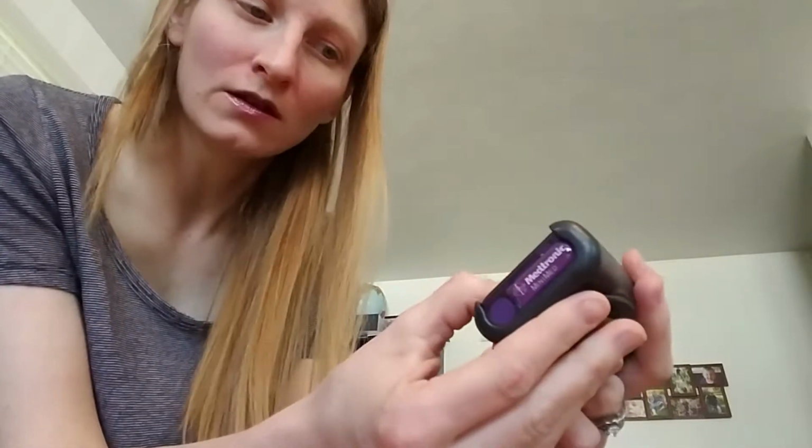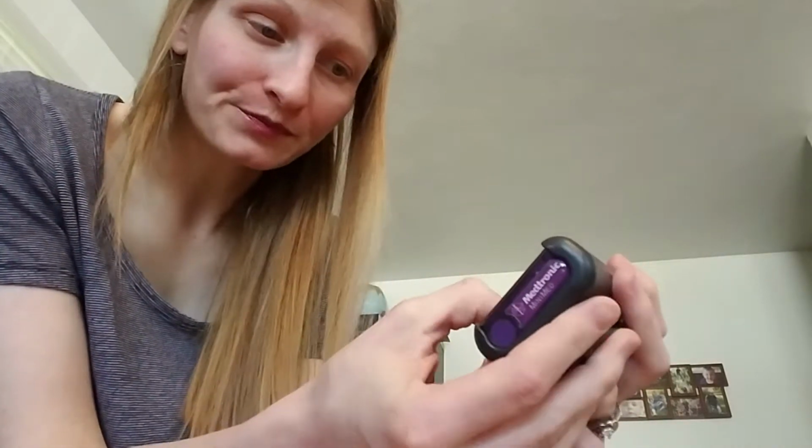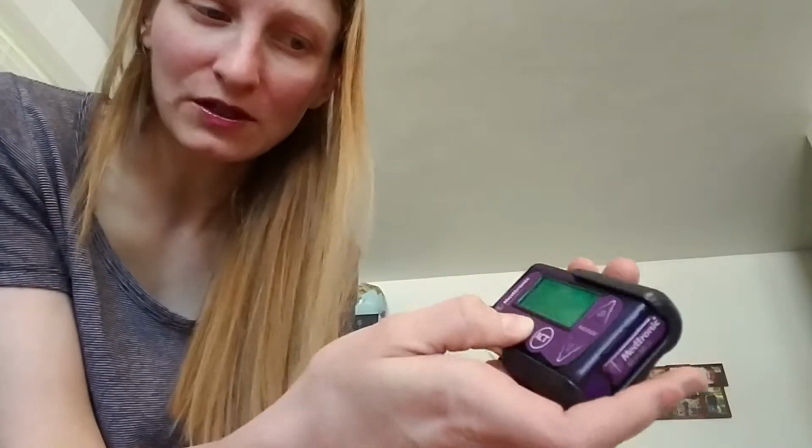I already have it primed because I am just changing the tubing, not the cannula, not the infusion site. So I do not want to fill the cannula, because then I'd be giving insulin that I already have in there, and that would be a dose I do not need. So it says push escape if you need to skip that, which is what I have here. And now it's all done. So that's what it takes every time that I need to change my tubing and my infusion, or not my infusion site, my reservoir.